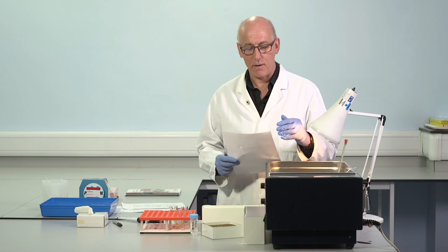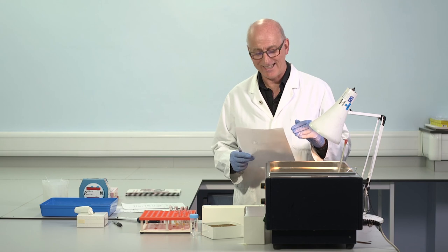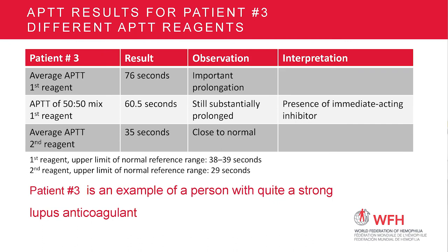Reagent number two, remember, this was a very high phospholipid reagent. Upper limit of normal, around 29. This was a patient in which the APTT with the first reagent was 76 seconds. Gross prolongation, very poor correction, 59-60 on the 50-50 mix, immediate acting inhibitor. Now we've got further confirmation. APTT with this second reagent, very high phospholipid, very insensitive to lupus anticoagulant, much less effect because of the high phospholipid, and a result close to normal, 35.